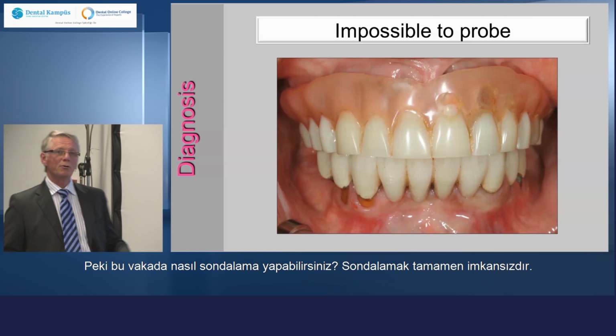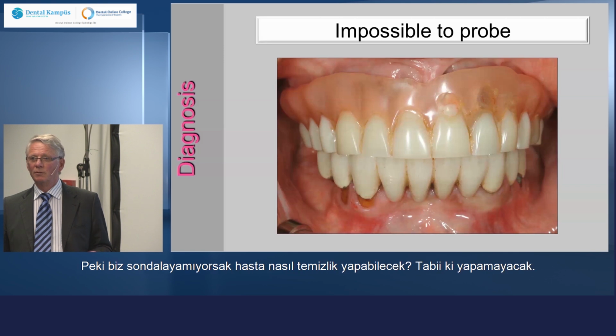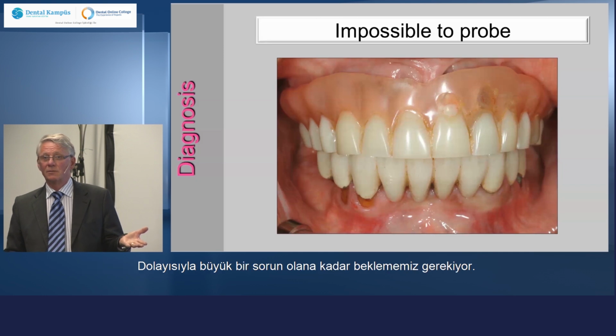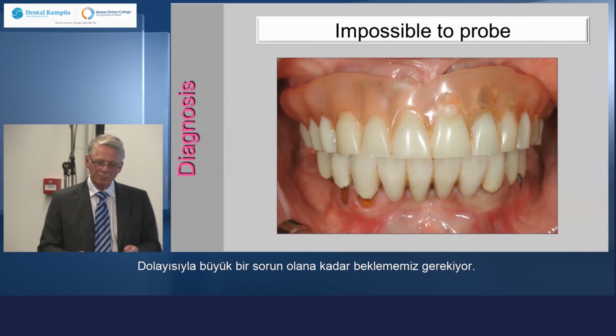And how could you probe in this case? It is completely impossible to probe. And if we cannot probe, how could the patient in such a situation do any cleaning? Of course they cannot. So then we just have to wait until we have huge problems.